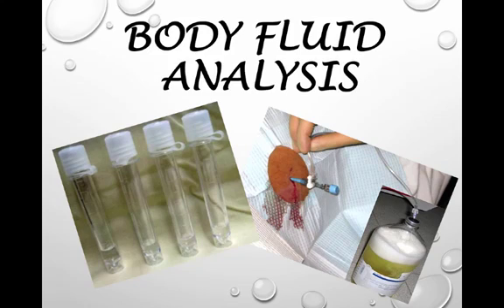Now, sometimes you will get tubes and sometimes you will get gallons. Some fluid collections, like some pleural fluid collections, for example, will come in large containers. So it's really important to know the specimen and what needs to be done for each of them.